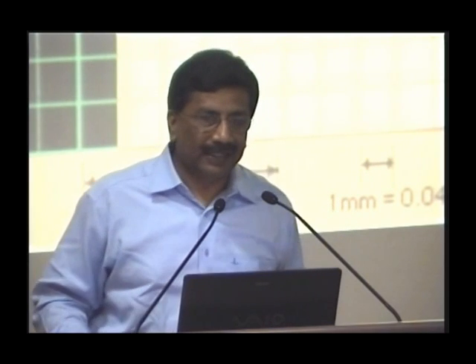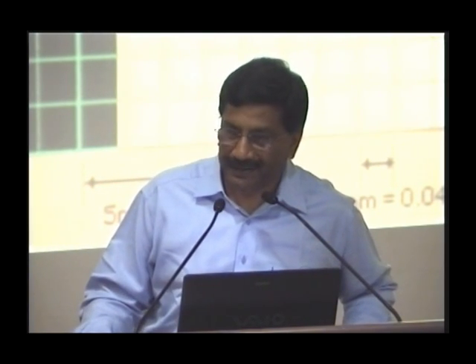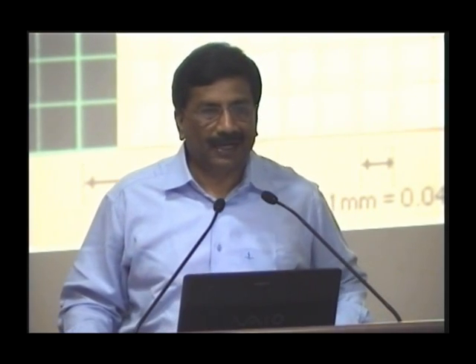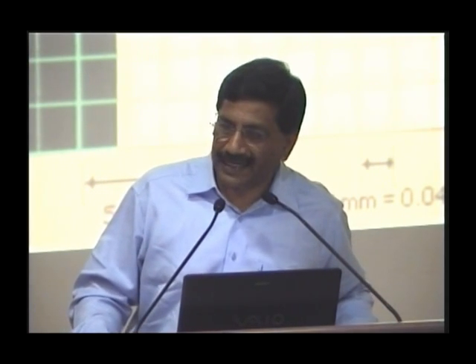For PR interval, the numbers to be remembered are 12 and 21. P wave, what number? 2.5. So PR interval, 12 and 21. 12 reversed is 21, isn't it? The PR interval should not be less than 0.12 second and should not exceed 0.21 second.